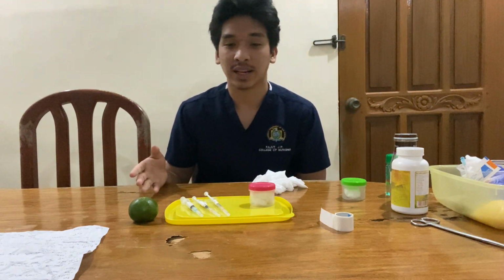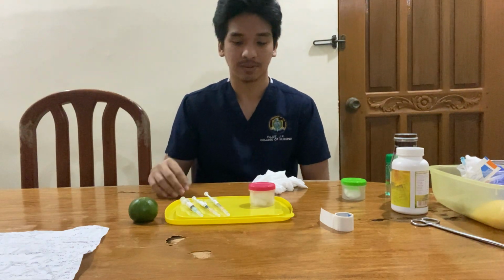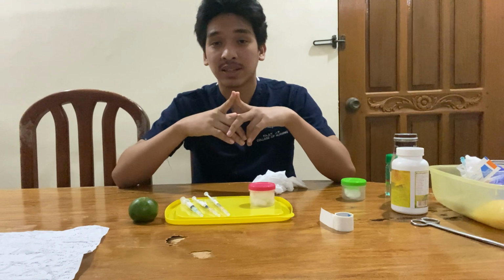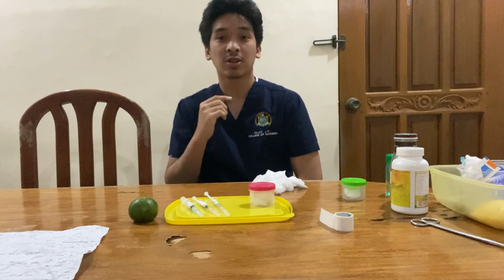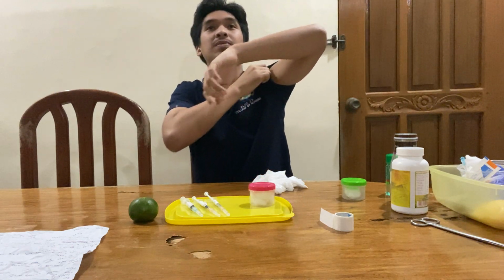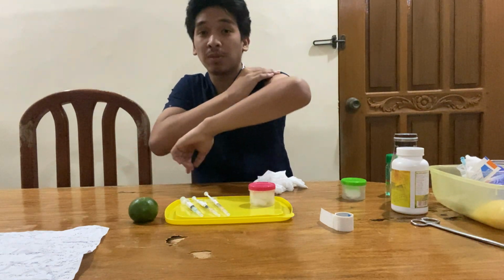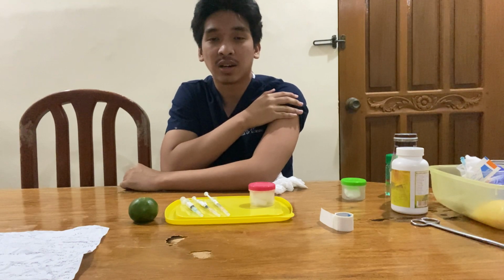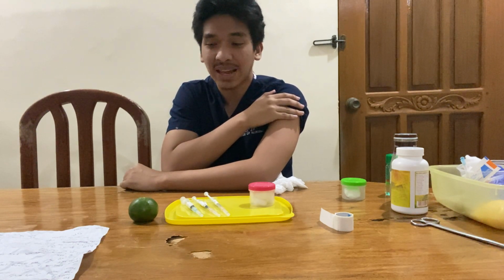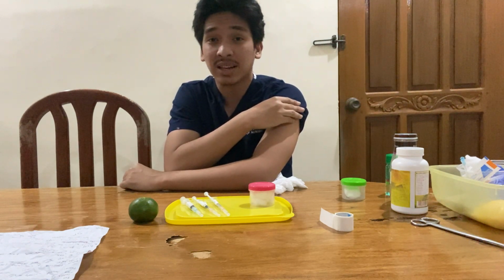Assuming that the patient is in his most comfortable position, I'll now inject the medications. First is the tetanus toxoid that will be injected intramuscularly. To locate the site, you find the shoulder blade. Okay, here, we'll place 4 fingers, and the ideal site is that there are no lesions, tenderness, hardness, and stuff like that too, and that will be our ideal site for injection.